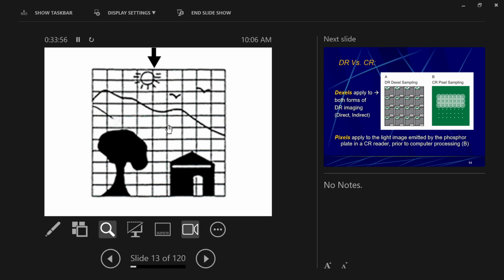But in reality, things aren't two-dimensional, right? Things are 3D, three-dimensional, right? So there's a third dimension that we're not seeing here, okay? So for voxel, you imagine, let's get a better one, take any one of these, right?